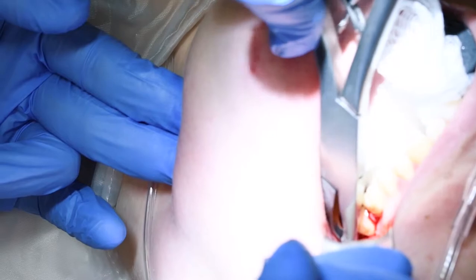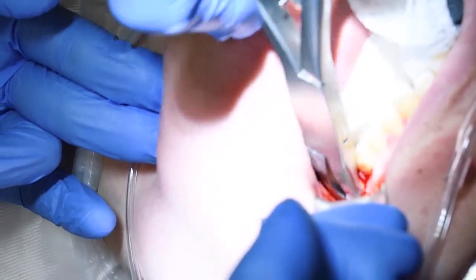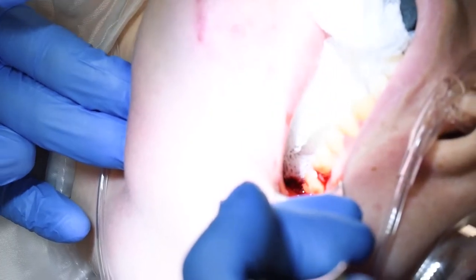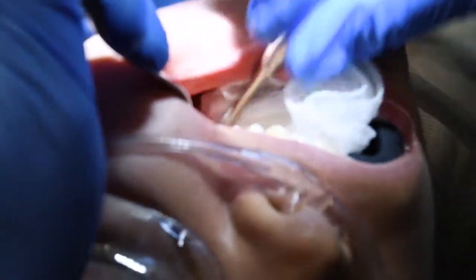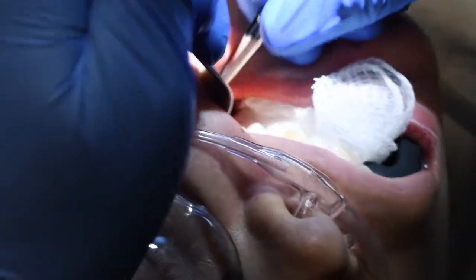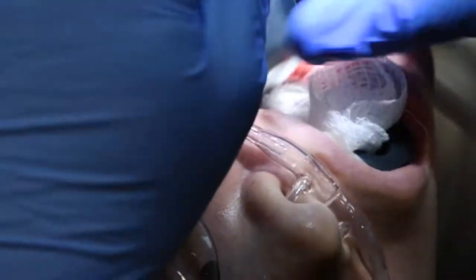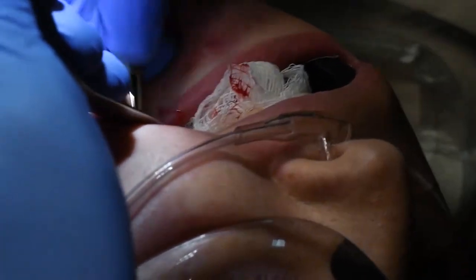This right here is called a follicle — that's extra soft tissue, part of the development of the tooth. We want to get that out as well. I'll get a curette to make sure there's no more in there, then the bone file to make sure things are smooth. I always like to palpate it to make sure it's smooth too — just a little bit of a rough edge in there, so I'll smooth that down a little more.